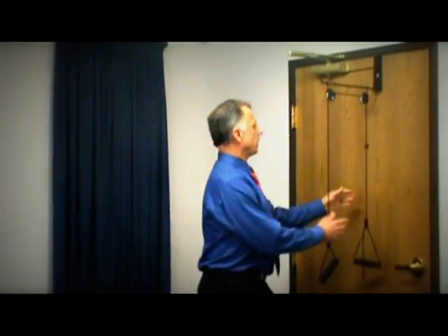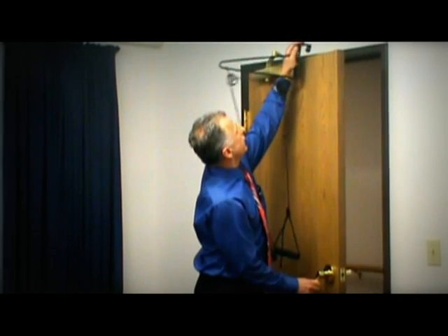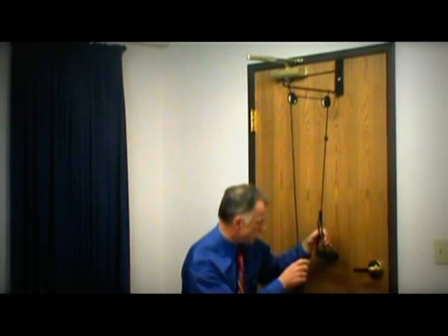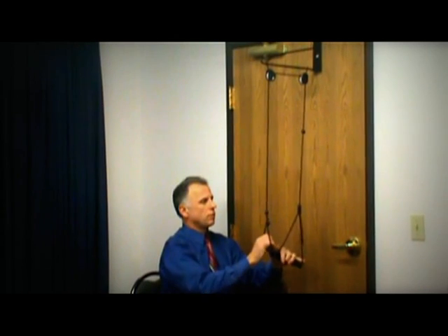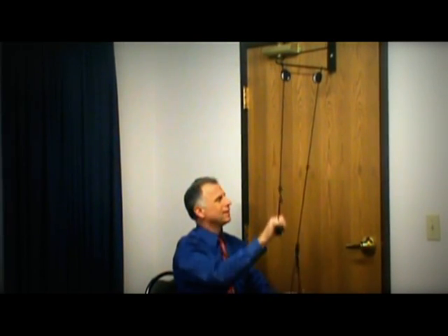And this one's kind of an elaborate one. This one hangs over the door. You can purchase this online through a medical supply place. If you Google it, I'm sure you can get one that goes over the door. It has two pulleys. This one here costs about $30, and I'm not happy with it at all for the price. I'd much rather make my own. Look at it squeak. Squeaks.